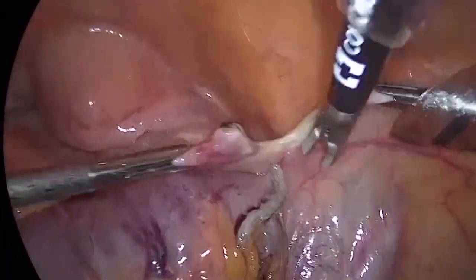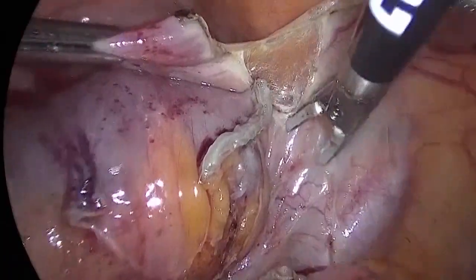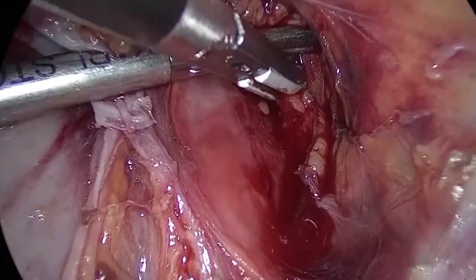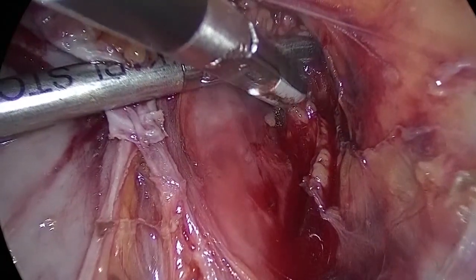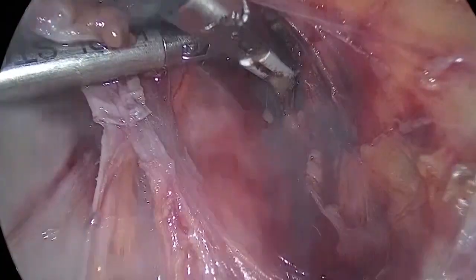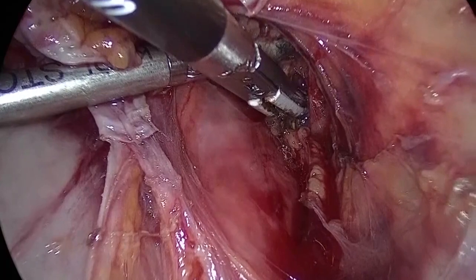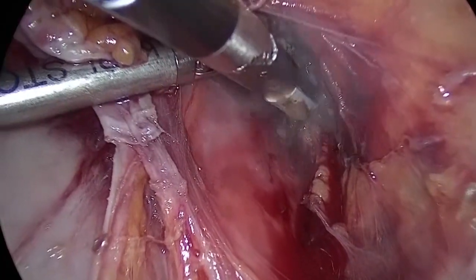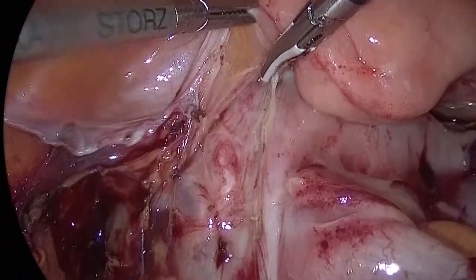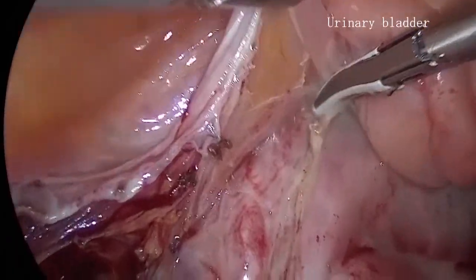The broad ligament of the ovary was dissected using a vessel-sealing device. Ligation of the right ovarian artery was performed using a vessel-sealing device. The vesico-uterine pouch was dissected to separate it from the bladder.